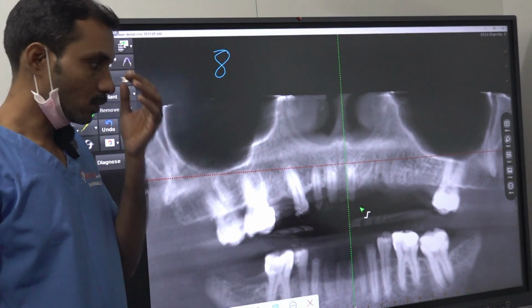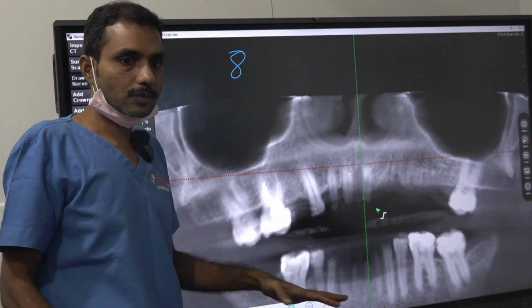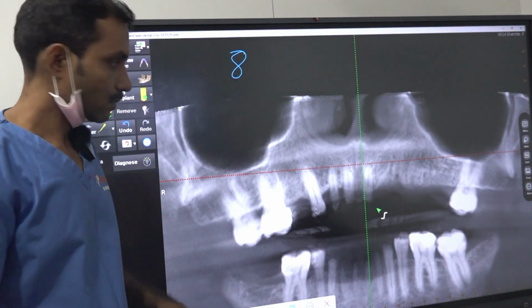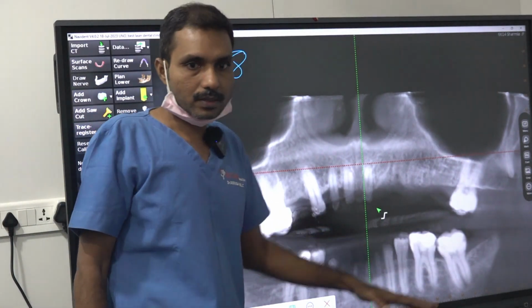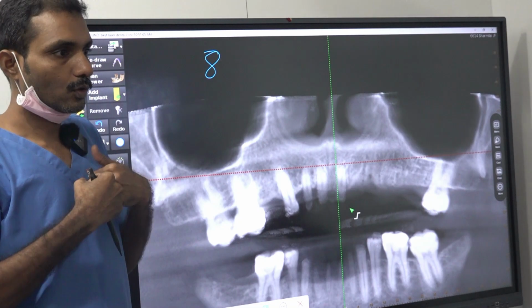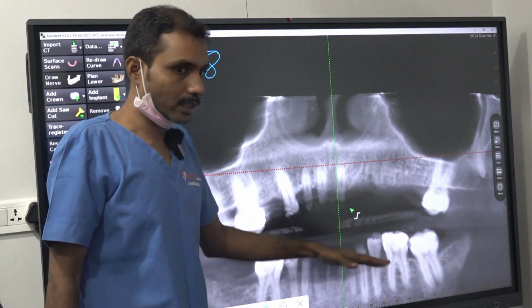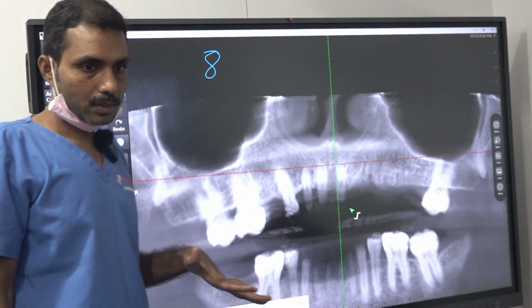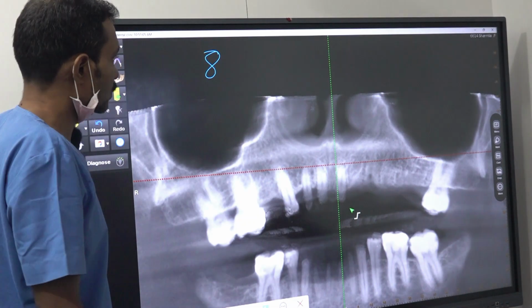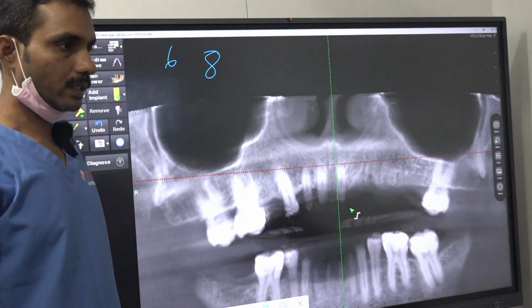One important rule to remember is place more number of implants if the opposing jaw is natural tooth. If the opposing jaw is natural tooth, the risk is more because the patient is going to give more force, because it is a natural dentition. So whenever the opposing tooth, especially the mandible, is natural tooth, give a sufficient number of implants. So usually we do with 6, but now we do 8 also.